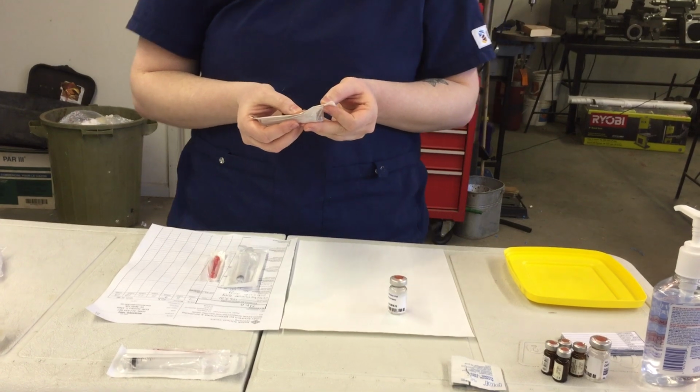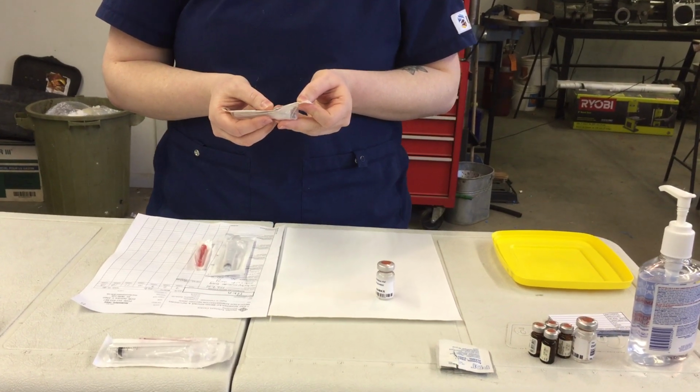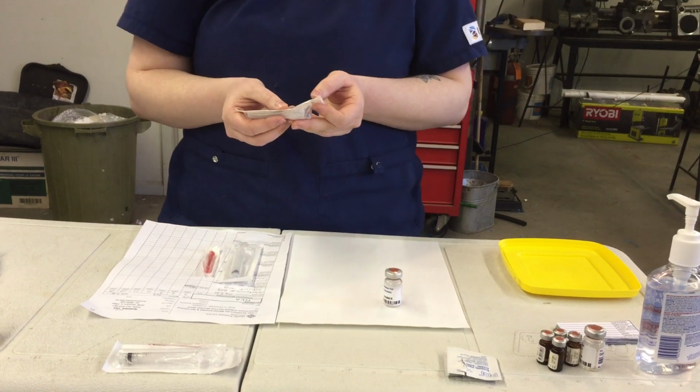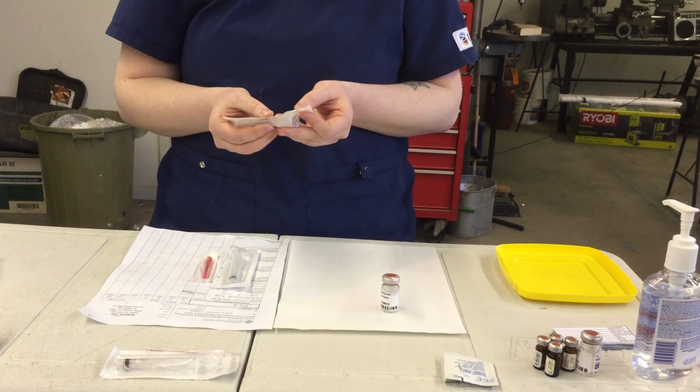So here I have a 22 gauge and 1.5 inch needle. This is correct because I need 22 to 25 gauge. This is 22, so that's right. And I need a 1.5 inch needle because we're going to be giving this medication in the ventrogluteal, because it is a large amount of 3 mLs and it is for an adult.